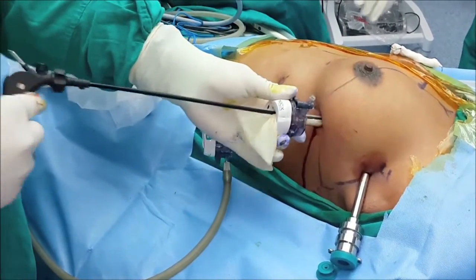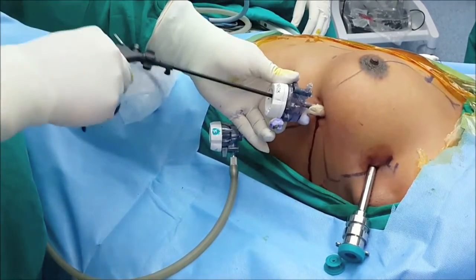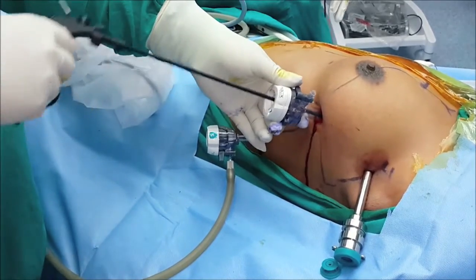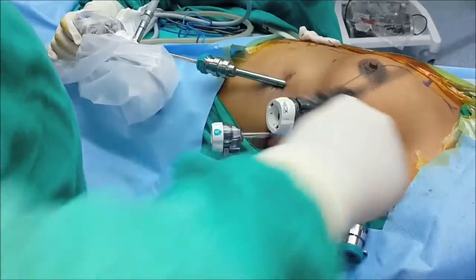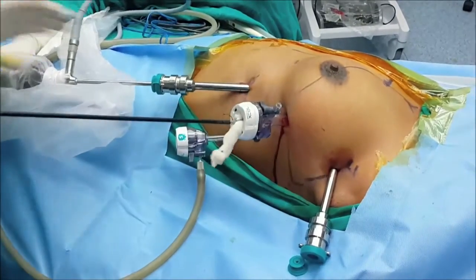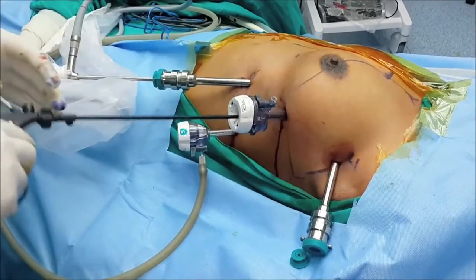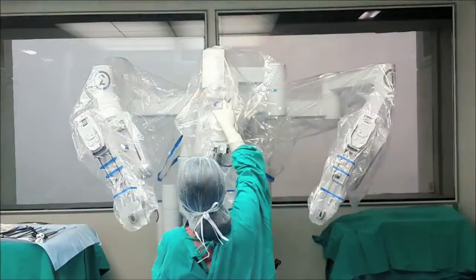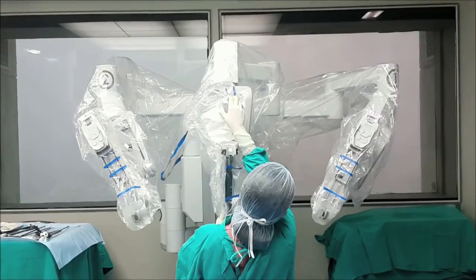Here is one more technique. After placing the camera port, we put an endo-specimen bag right before we start the surgery and drop it in the apical part of the chest. We also put a rolled gauze piece at the beginning of the surgery so you don't need to ask the assistant for it again and again. This saves about 10-15 minutes of time in the post-operative period.